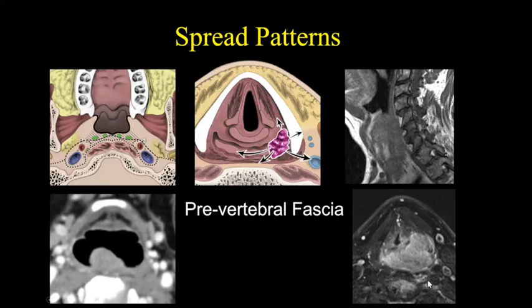There have been some papers that have determined that if you perform T2-weighted MR and there's edema involving the prevertebral muscles, this is indicative of invasion of the prevertebral fascia. Now, I have to admit, I haven't done very many of these to specifically look for these. I know other centers do it. I still think that surgical assessment is important, but after talking with the surgeons, they do rely on MR.